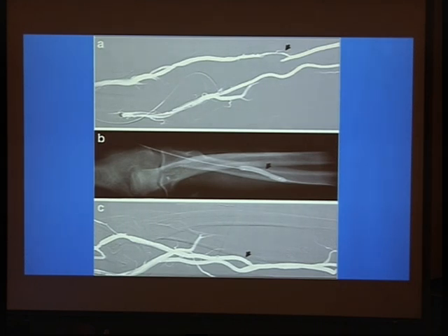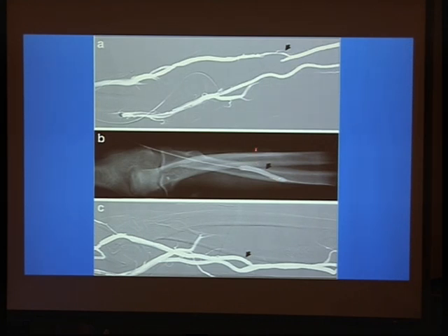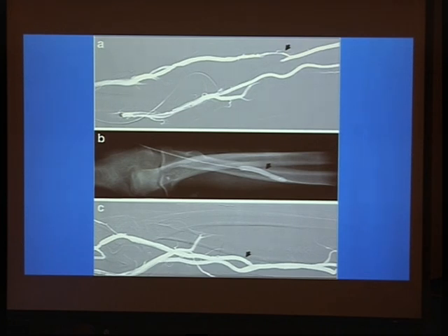Radiology is not only for diagnosis — we can also do intervention and manage the complications of the fistula. In this case of stenosis of the draining vein of the fistula, we can compare the caliber at the stenosis with the normal caliber. A balloon catheter is introduced inside the stenotic segment and inflated to make dilatation of the draining vein. This is the control film after dilatation — the vein has regained its normal caliber. It is an outpatient procedure done simply using radiology.